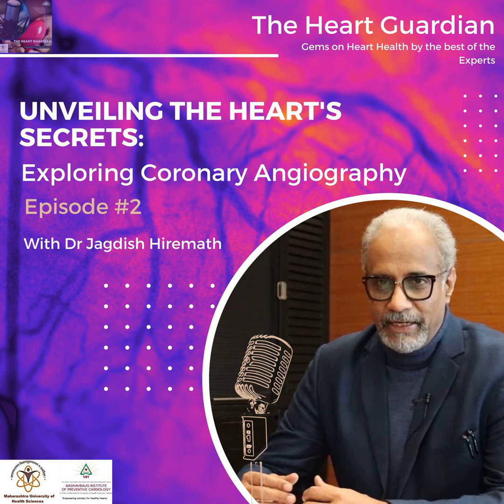An iodine-rich dye or contrast medium, which is inert and safe, needs to be introduced inside the arteries. So it flows through the blood and pictures can be taken. The gold standard, invasive catheter angiography, is performed in a special room called the cath lab. This area is sterile like an operation theatre.